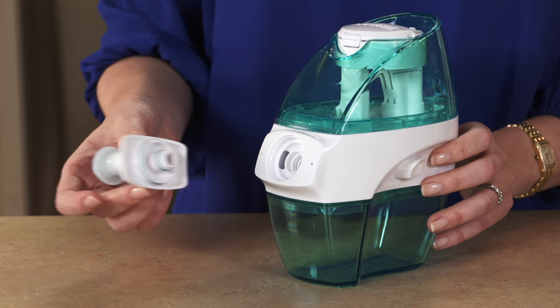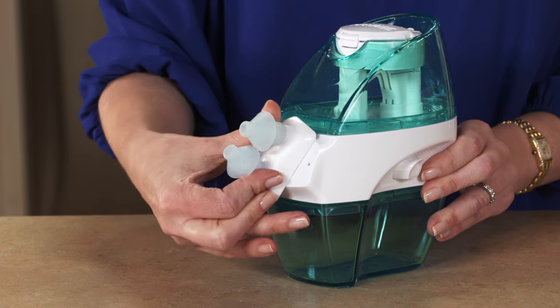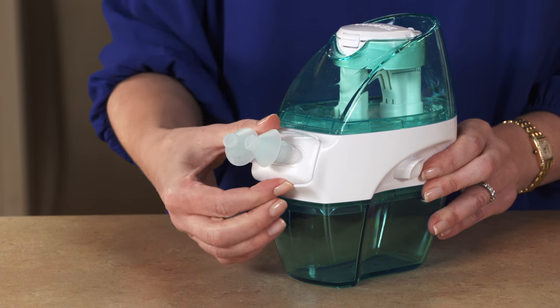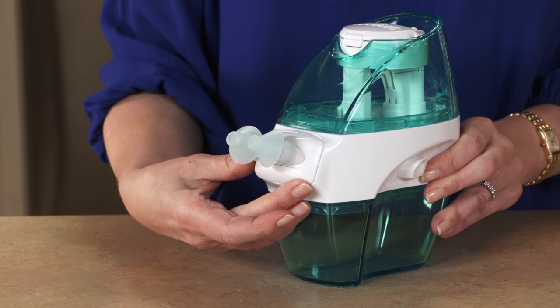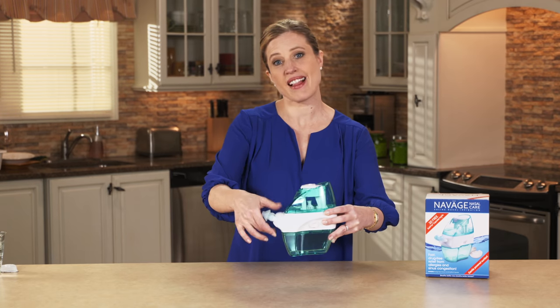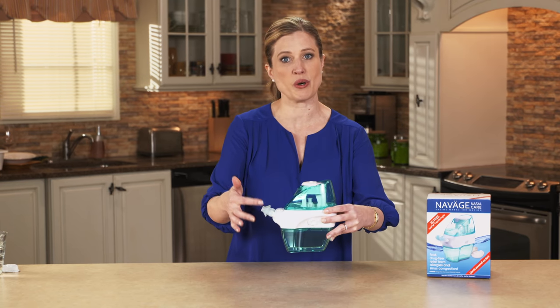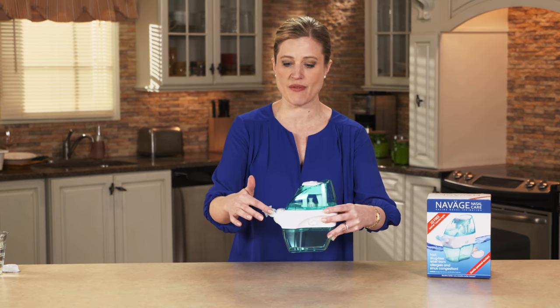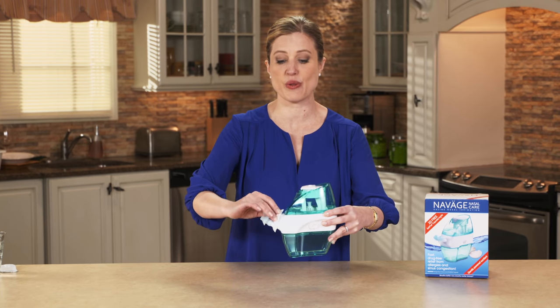Let me show you how to put the nasal dock onto the device, and I'll also show you something really cool. You can turn the nasal dock around — it'll actually go 360 degrees around. What that allows you to do is choose the direction that you want to go: it can go from your right nostril through to your left nostril, or you can start from your left nostril and have the saline flow through to your right.